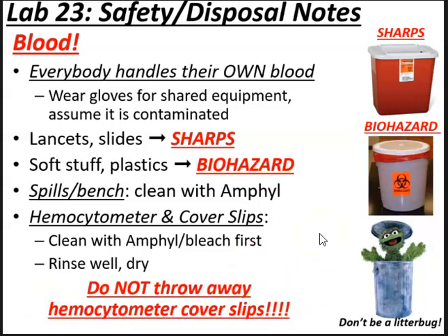they will be reused. So I will be posting the blood typing worksheets along with this video. The majority of the video is about blood typing, what genotypes determine the blood typing, doing your Punnett squares, and that will be discussed in the discussion of this lab.